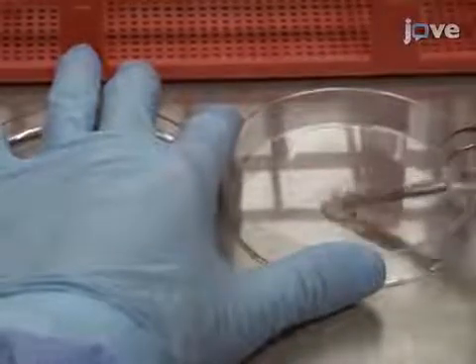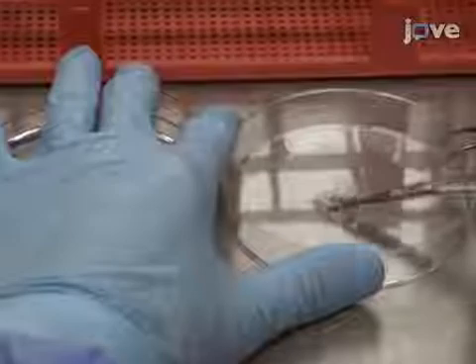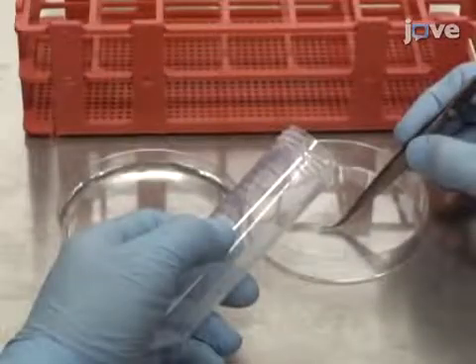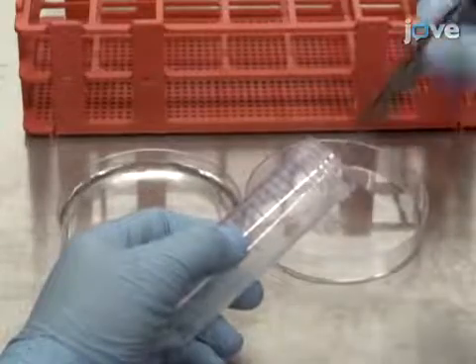Cut the tissue into 25 to 50 small pieces approximately 2 to 5 square millimeters in size, and use forceps to transfer them to a 50 milliliter tube.